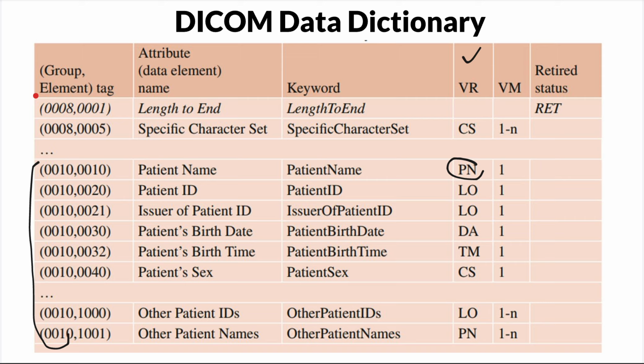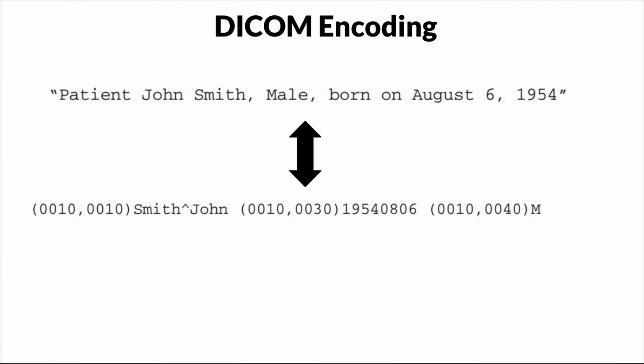Now let's look at the top here. If you look at it, it's different from that. In such a way that if you look at the tag 0008, that one talks about something different. We will learn how to read DICOM files when I come, and you should be able to read and interpret your results and write reports based on it.